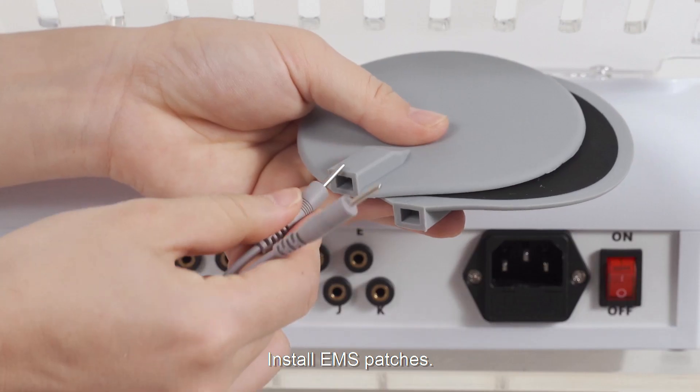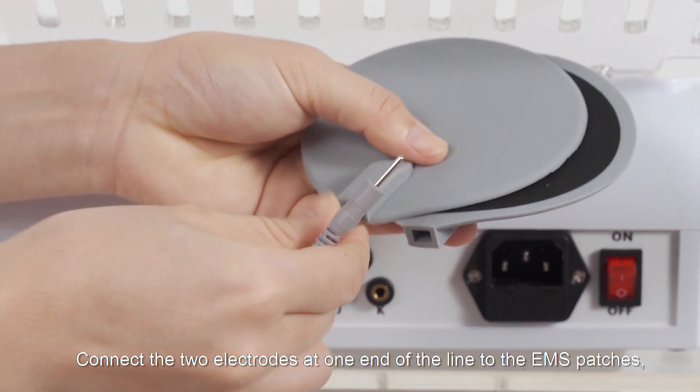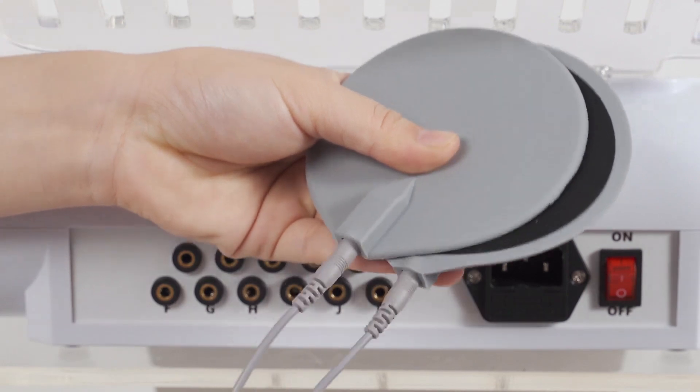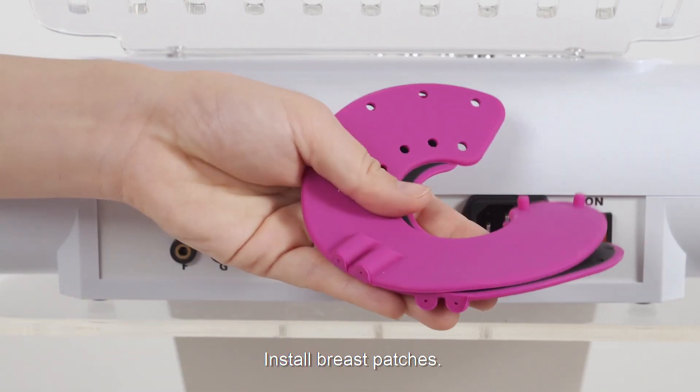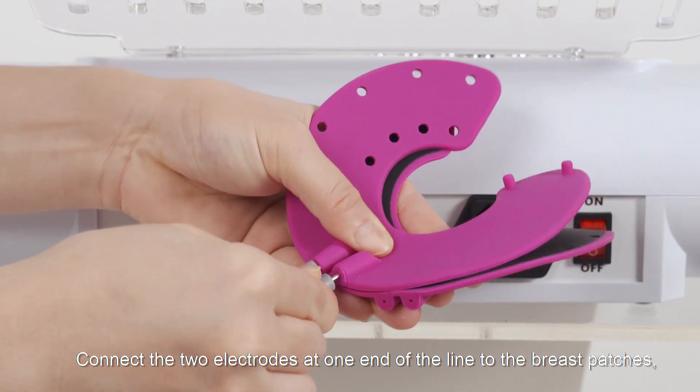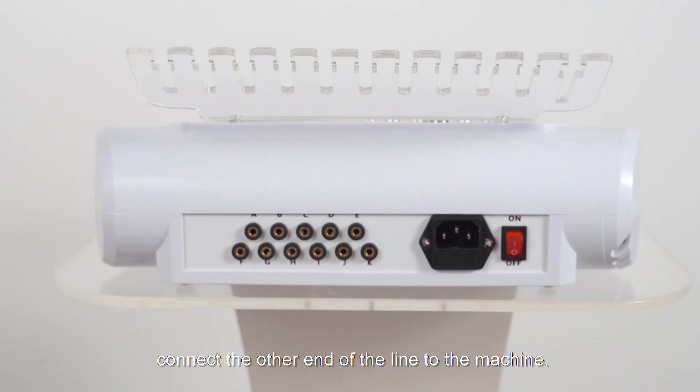Install EMS patches. Connect the two electrodes at one end of the line to the EMS patches. Install breast patches and connect the two electrodes at one end of the line to the breast patches. Connect the other end of the line to the machine.